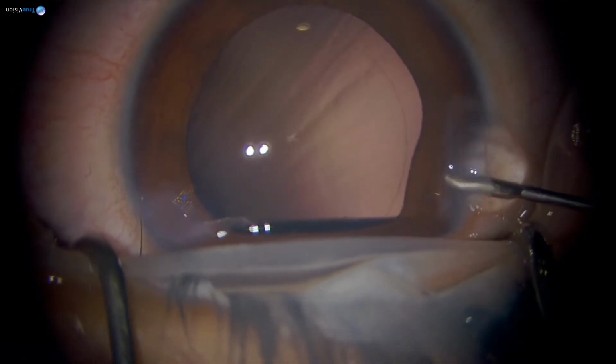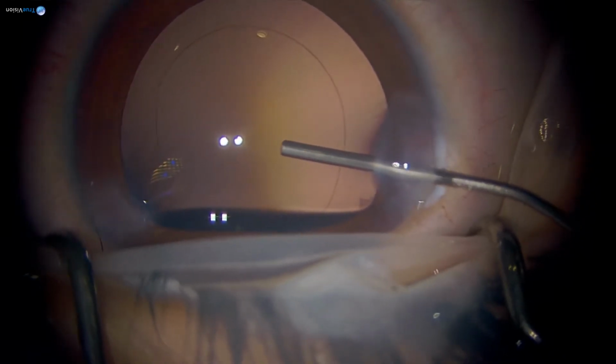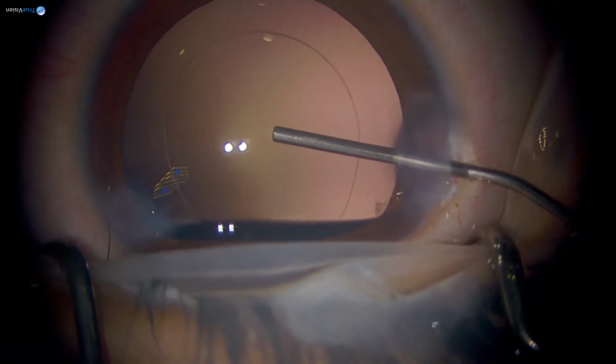how big an opening do you want for the posterior capsulorhexis? And how deep do you go? Where does your probe go relative to the posterior capsule?